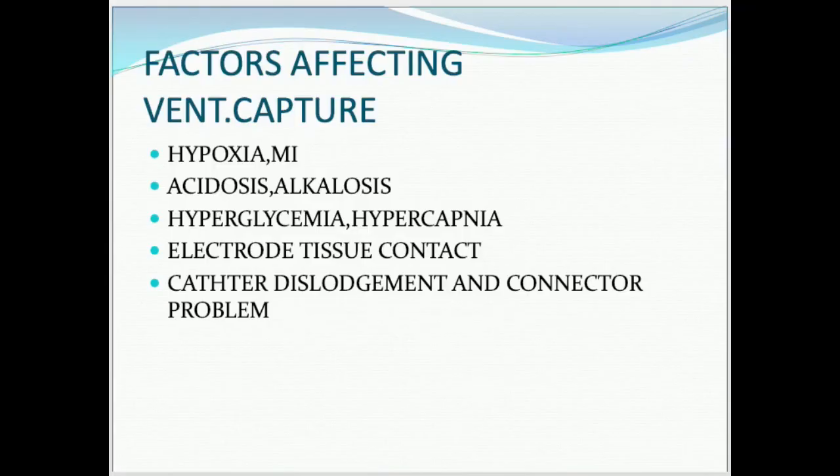The following factors affect ventricular pacing capture during transvenous pacing, which include hypoxia, hyperglycemia, and hypercapnia. These conditions can be corrected by reducing the drug levels and increasing the pacing output.